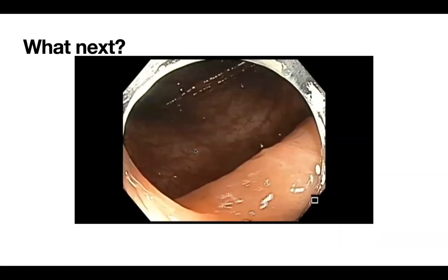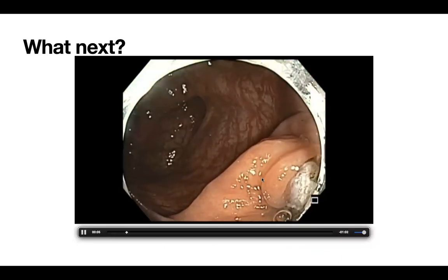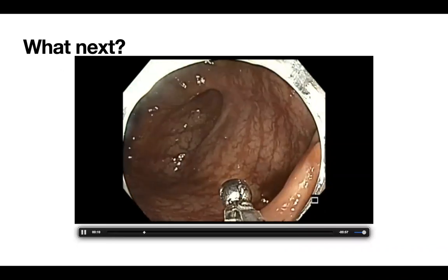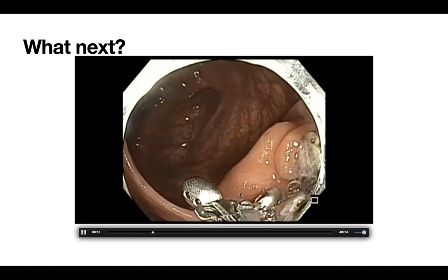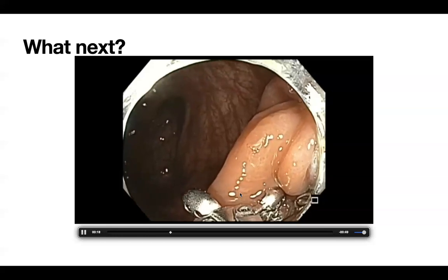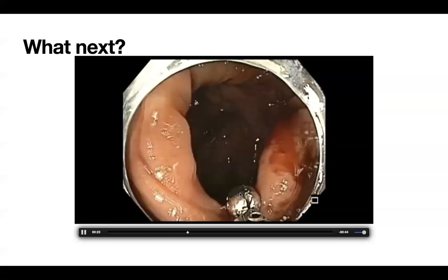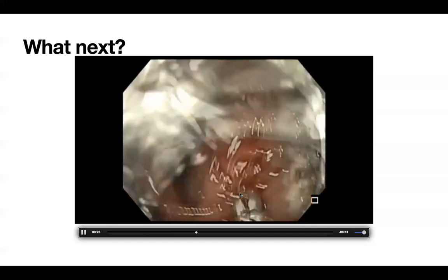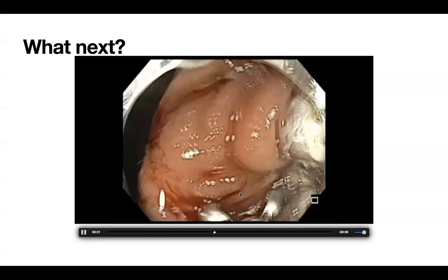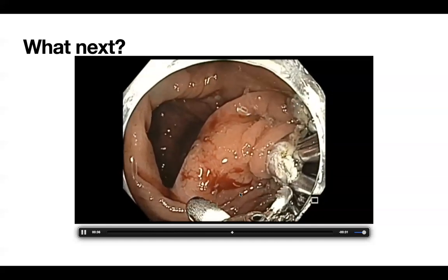So you can see here, I'm going to show you here, right? There's a small polyp here, and we felt that actually there were two small polyps around that area. We decided that we would just remove that now rather than wait, because if it comes into the scar tissue later on, you wouldn't know whether it is a local recurrence or a polyp that you overlooked.